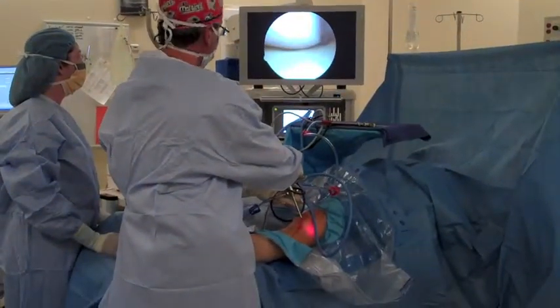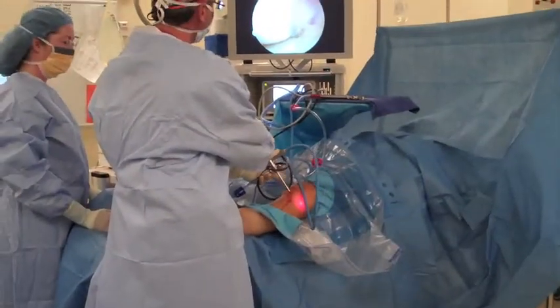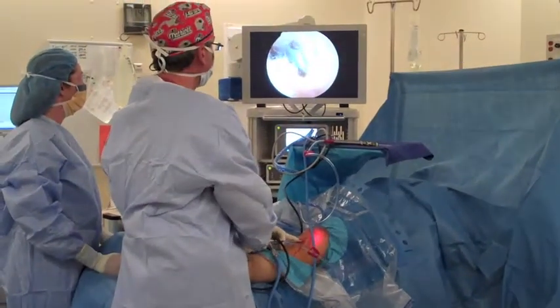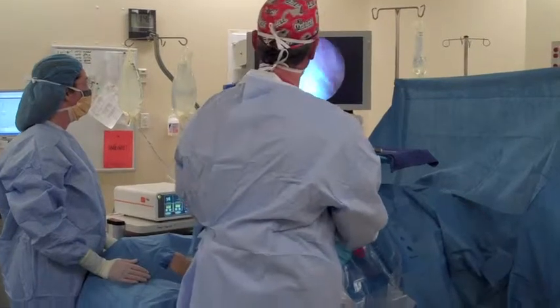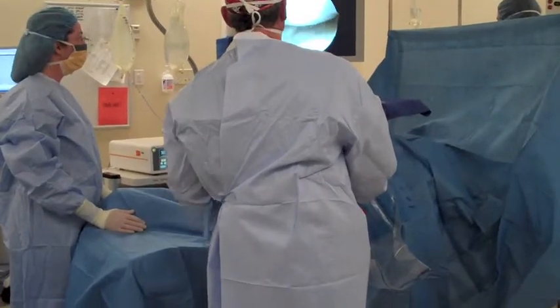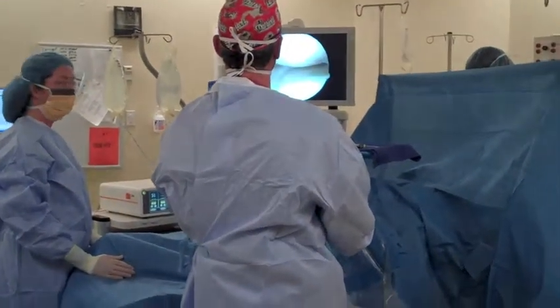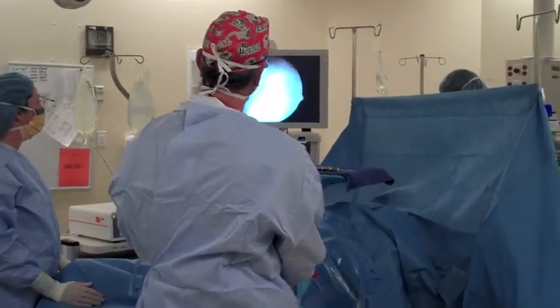The other thing that I would point out is that the incisions that I'm using here are only 1 centimeter. The very small incisions, we actually close those incisions with a special suture that is bioabsorbable, so no sutures need to be removed. We describe this really as a Band-Aid surgery. Patients can come in and basically be showering and bathing the day after surgery. So it's really quite remarkable how quickly you can get up and moving for this type of situation.